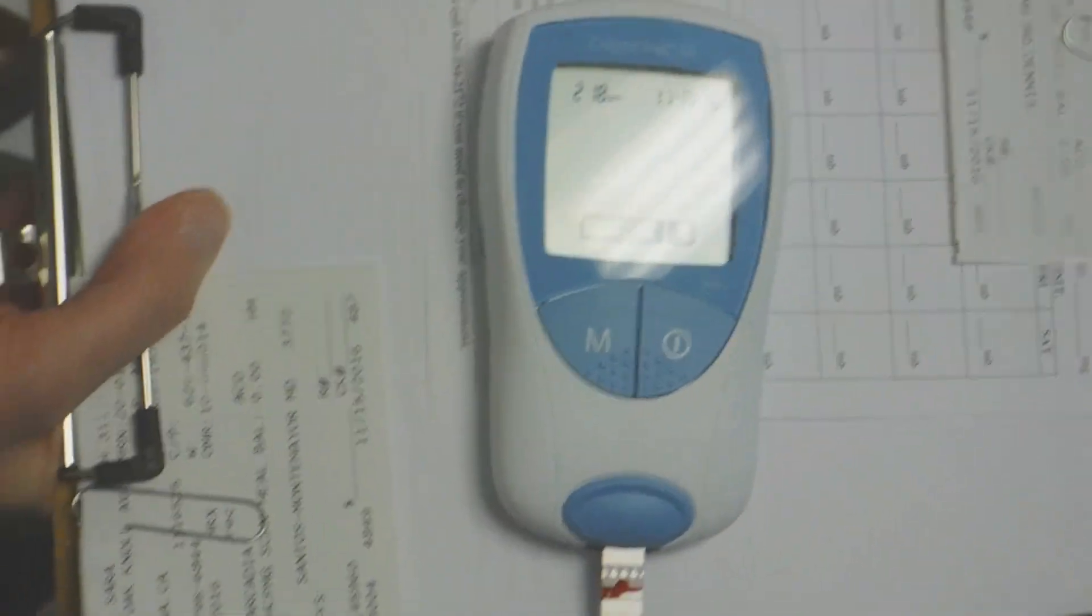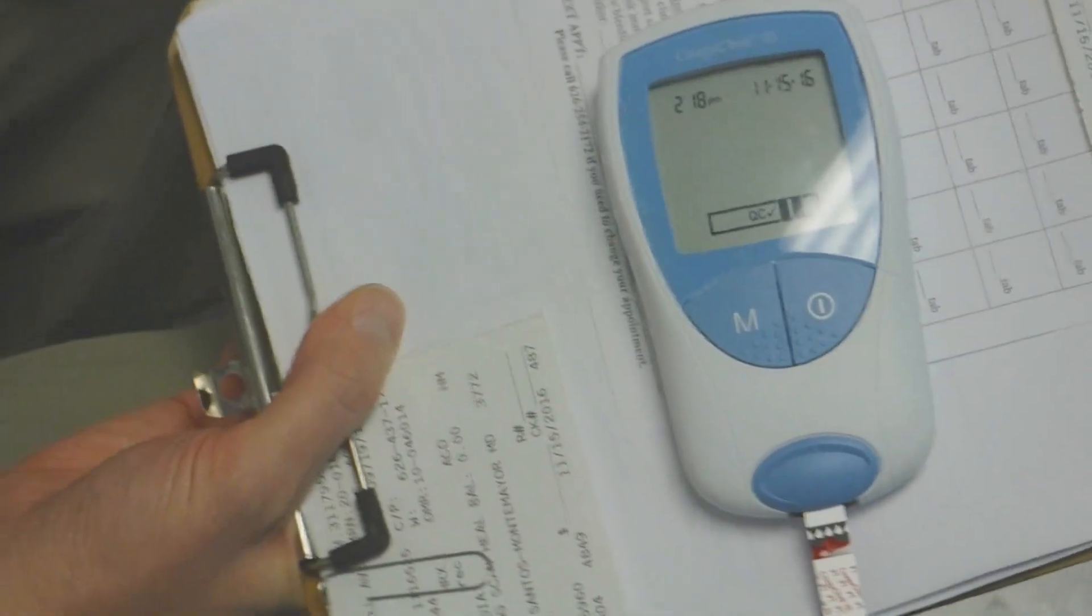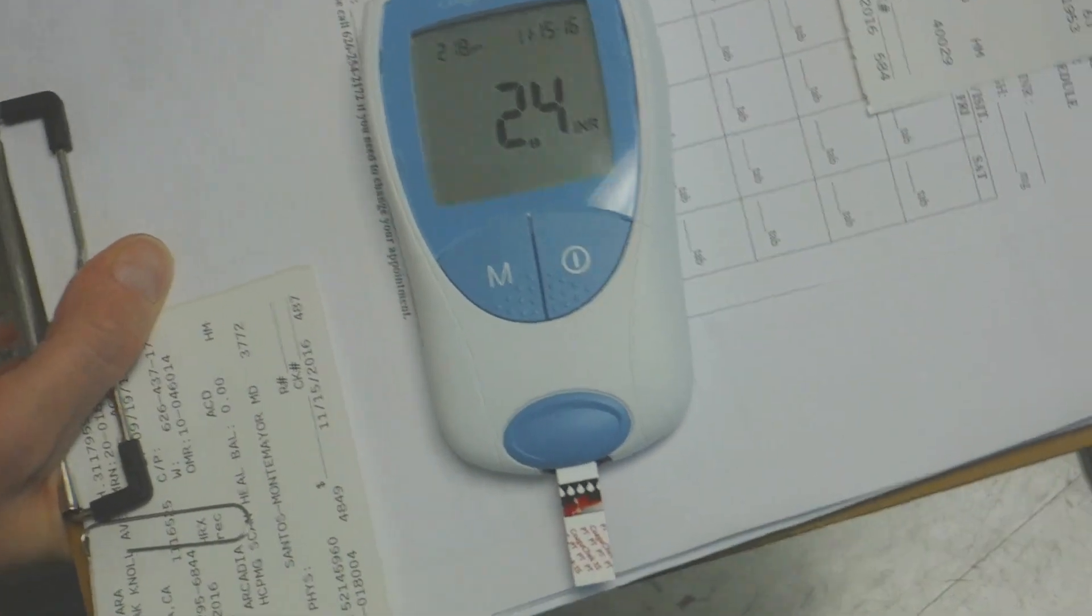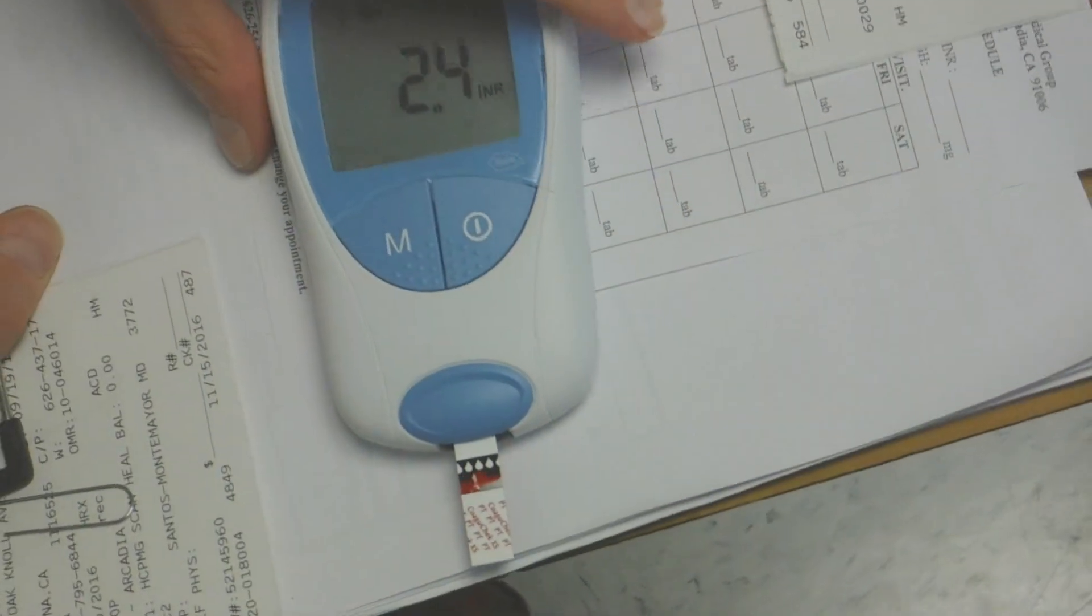Now there's an internal quality check, that's what that's saying right there. You're going to be a little thin. How do you know? Because it's taking a little long to register. I just had a salad. No, I'm good. We've got to try it again with yours.